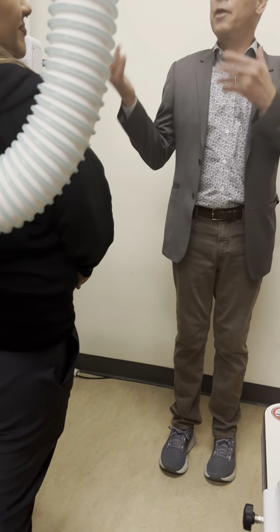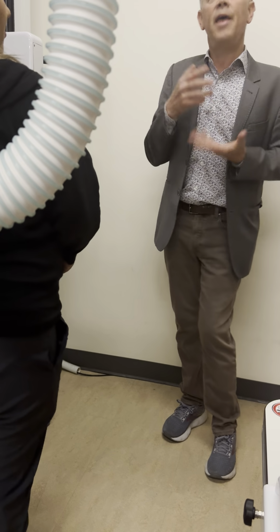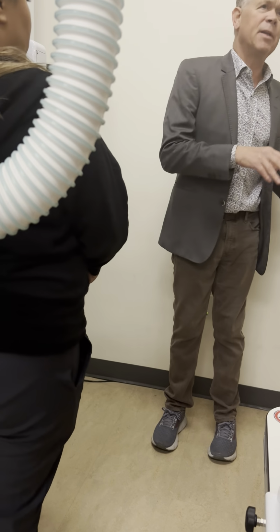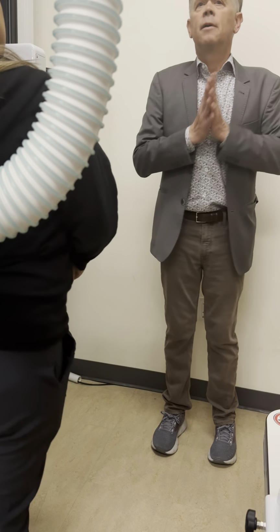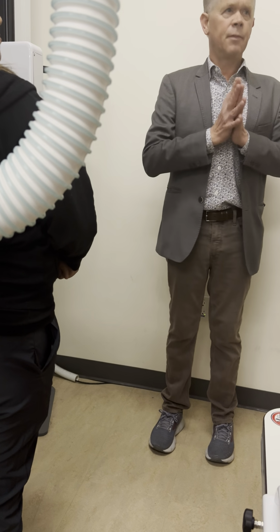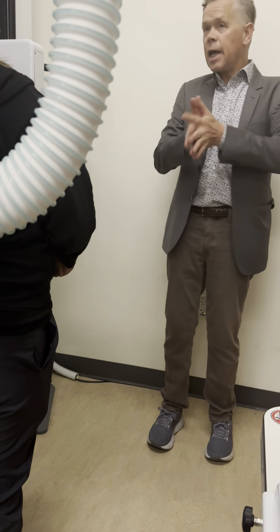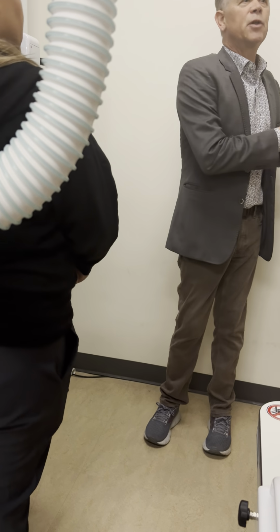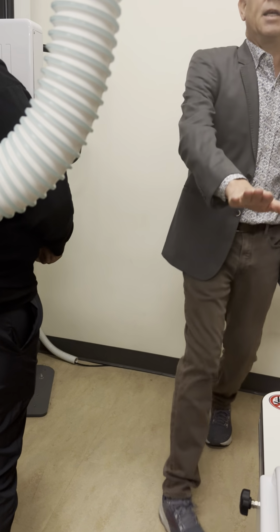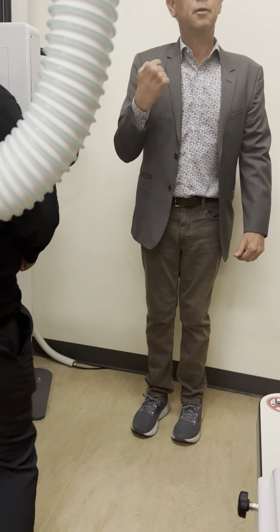So this is the struggle in terms of it. The thing that we know about imaging is that when we tell patients to do things, they will do what we ask. It's when other people become more sloppy, like, I'm your friend, I'm busy talking to you, I don't really care. Given the skull work, facial bones, and the sinuses, you have to hold the position for the patient. You will get good at it the more you practice. There is a 7-degree difference. It's a test question, it's a quiz question. It's the difference between a good image and a bad image, repeating the image. So that answers that piece of it for you. You could do it though, because all you have to do is focus on that and let the other person know they need to focus on holding the position.